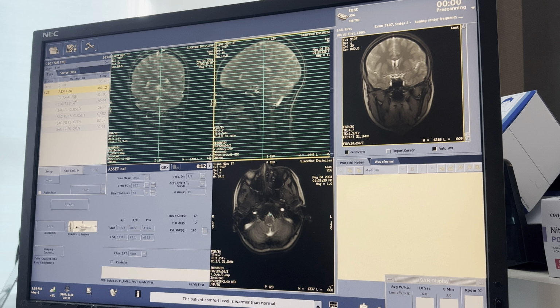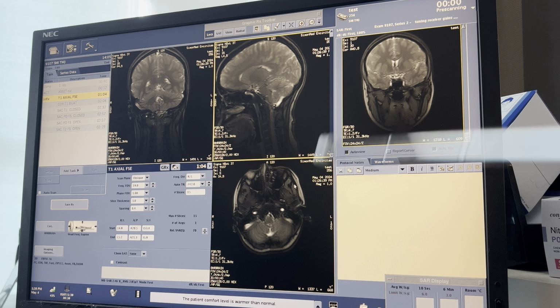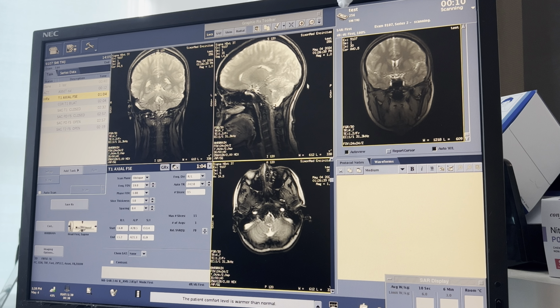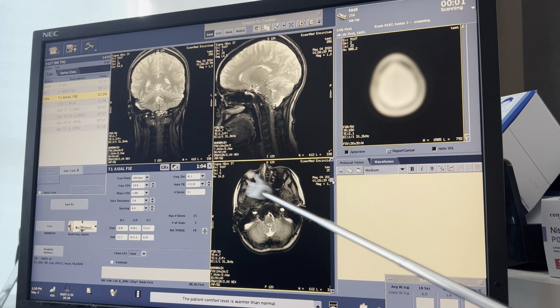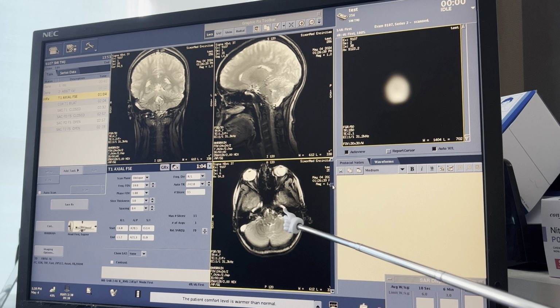Alright, let's go into that axial. Okay, so we're gonna scroll through here. Let's window it up and to the left. Perfect. And now we're gonna unclick update all. Okay, so what we want to look for are the beans. So you could actually see them right here. But if you can't find those, you can always look for Shrek instead.